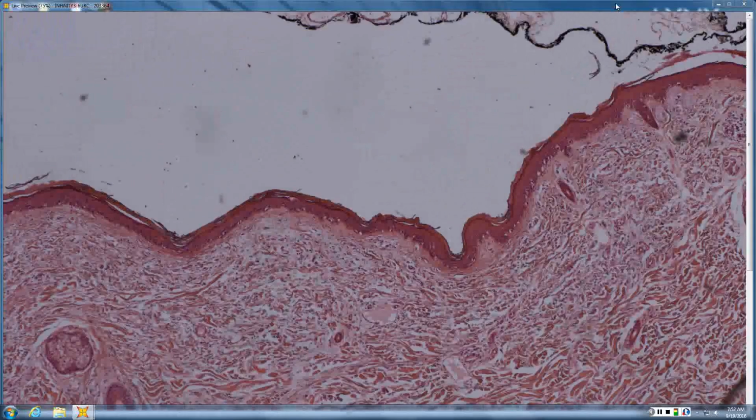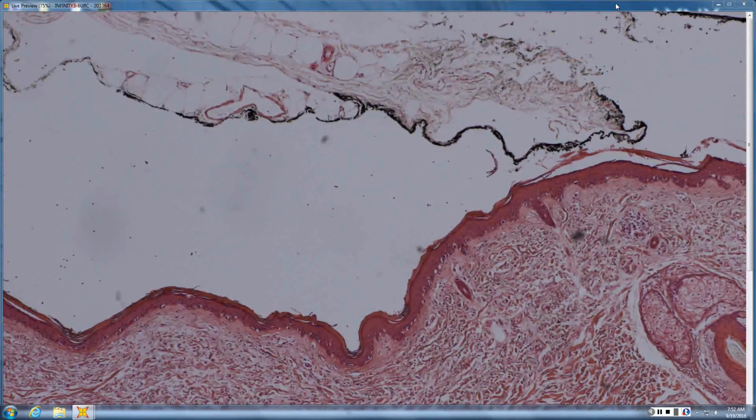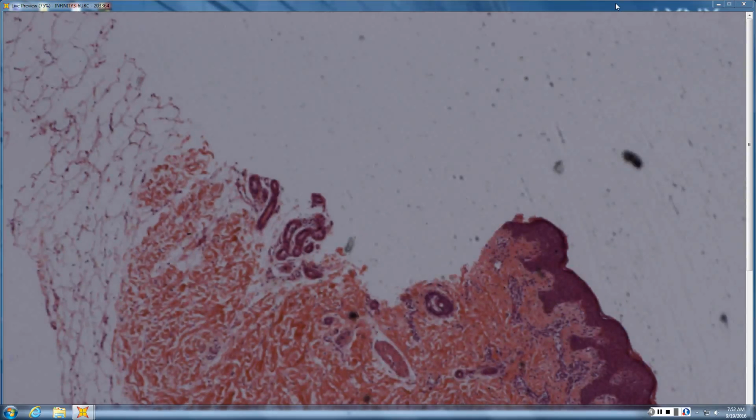Now, does that mean no one will ever take a punch out of that? Of course people will take a punch out of it, so you have to be careful. Sun damage, facial skin, lichenoid. Certainly never called benign lichenoid keratosis on the face. Lichenoid AKs do occur on the face, but always be careful about lichenoid regression. And here we have some large melanocytes at the junction, poorly nested, hyperchromatic as a hint. But most of the melanocytic lesion will be regressed, so you won't typically see it.